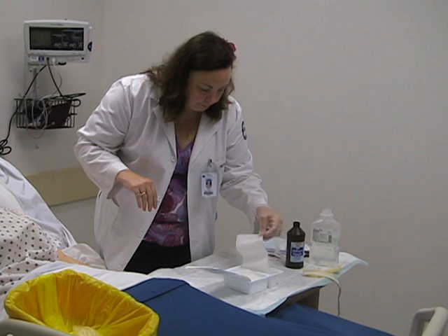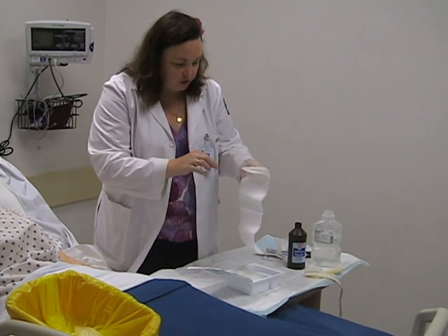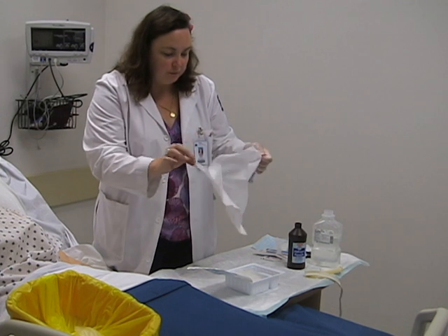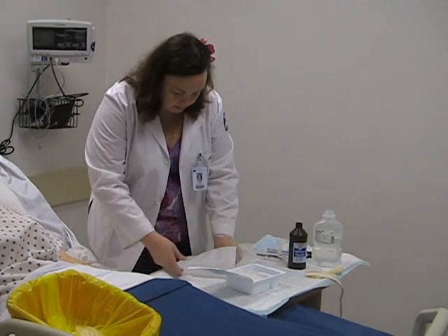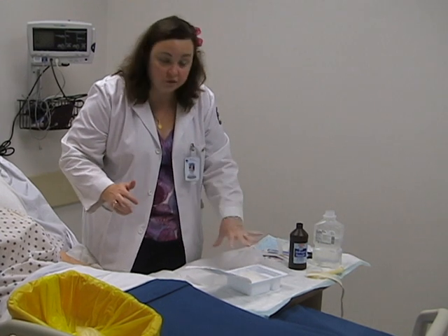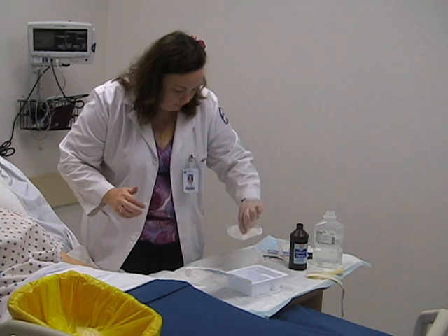We're going to take out the drape. When you look at the drape, one side is dull and the other side is shiny — the shiny side goes down. This is your water-impermeable side. You would spread it and lay it on your table. Now you have a sterile field to put your supplies. I'm going to put my glove here and take out all my supplies.